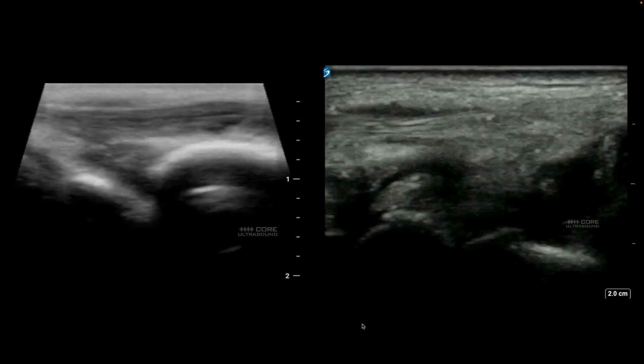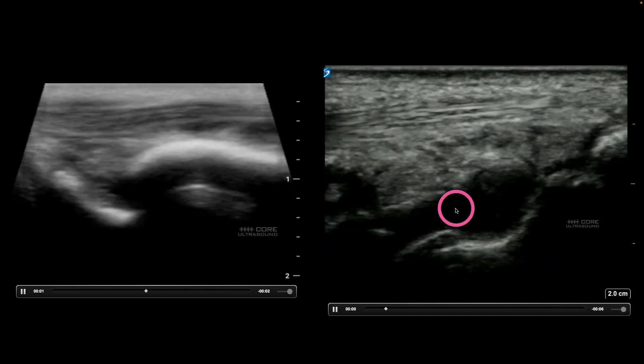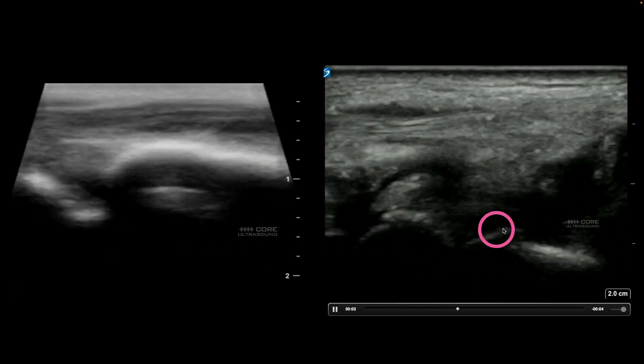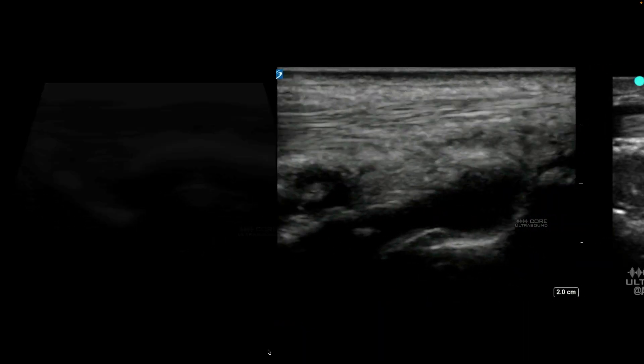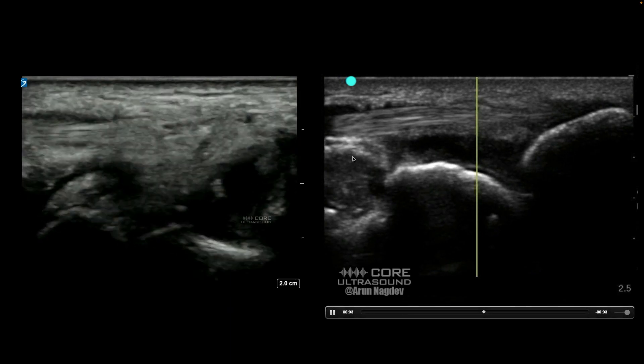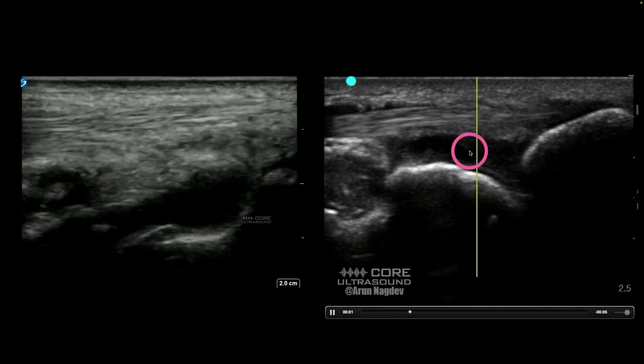Now let's compare normal to an effusion. We have normal over here, and right here we're seeing hypoechoic fluid inside that joint that is consistent with a wrist effusion. Here is another example — here is that extensor tendon, and here is that fluid inside of that joint.